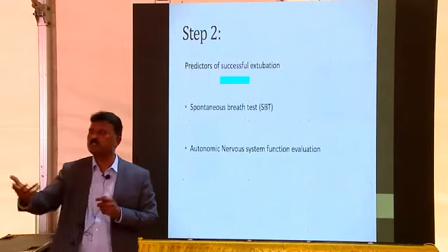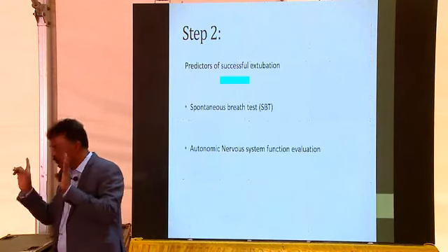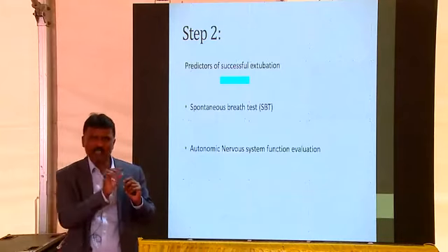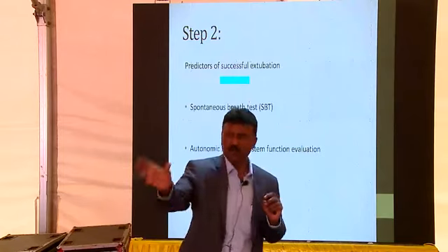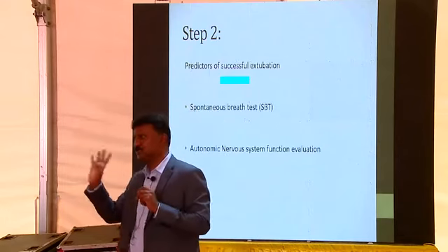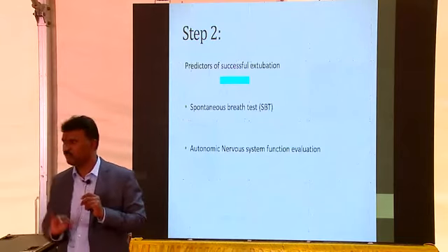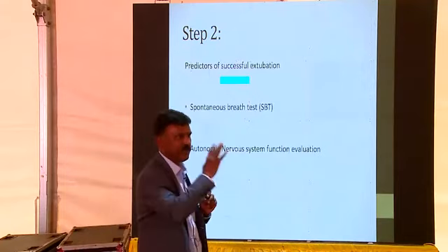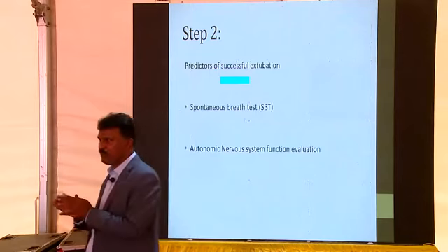The narrower the radius, the more the resistance. What we are doing is 5 minutes. You change the knob to ET-CPAP. Keep a CPAP of around 5 centimeters. What do you look for? Two things. One, you look for an episode of bradycardia, which is defined as a drop in heart rate for some seconds, even if you have increased the FiO2 by another 10-15%. Two, a saturation of less than 85%.